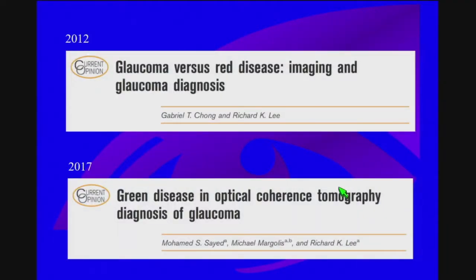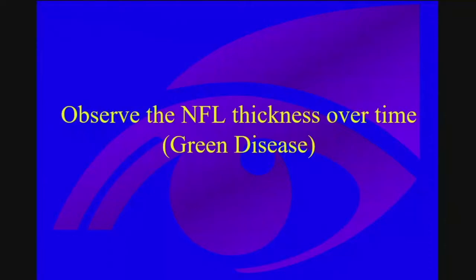So what I'm going to talk about is red disease versus green disease, where red disease is really a false positive. And this came about because many of my patients would come in as a tertiary care referral center saying, my doctor's not treating me. I have this thing, it's all red, and my doctor says, I don't need any treatment. I'm coming to you. Well, they had actually a very good glaucoma specialist who actually understood the OCTs and things that they were presenting for data.